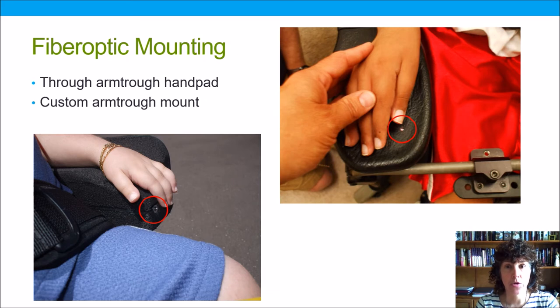Here are two rather custom mounts for clients I've worked with. On the right we have Julian, who has spinal muscular atrophy type 1 — there's a little fiber optic placed by his thumb, right on top of a hand pad attached to the end of his arm trough. On the left we have Fareed, who has the same diagnosis but needs to pull his finger back toward the switch to activate it, so we've sandwiched the switch cable between two pieces of foam to create a custom arm trough.